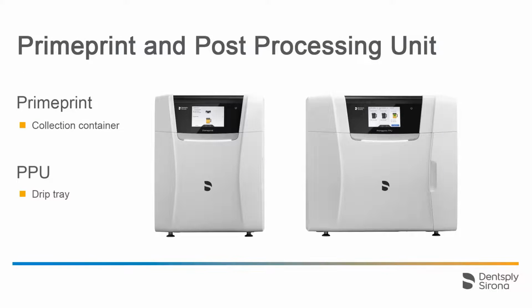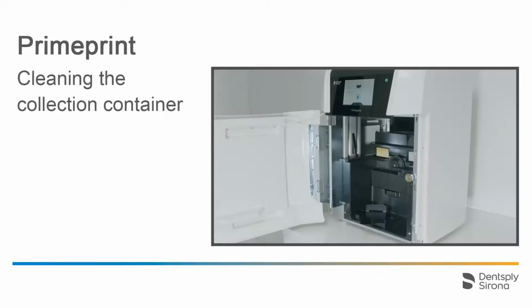Next, we will look at cleaning the Primeprint collection container and the post-processing unit drip tray. The Primeprint collection container is located below the material unit and serves the purpose of collecting leaking resin, a situation that can occur in case of a damaged material unit.